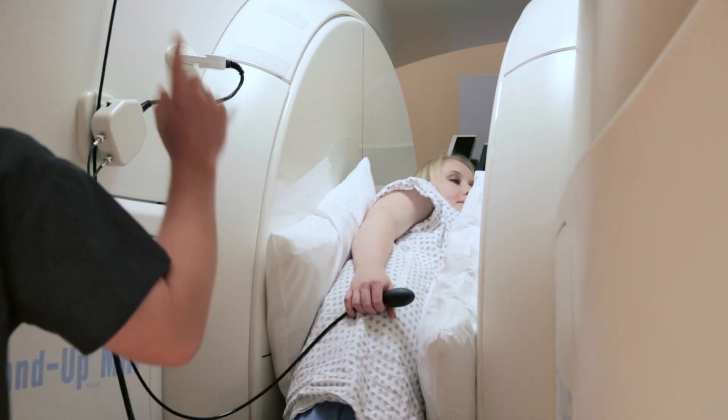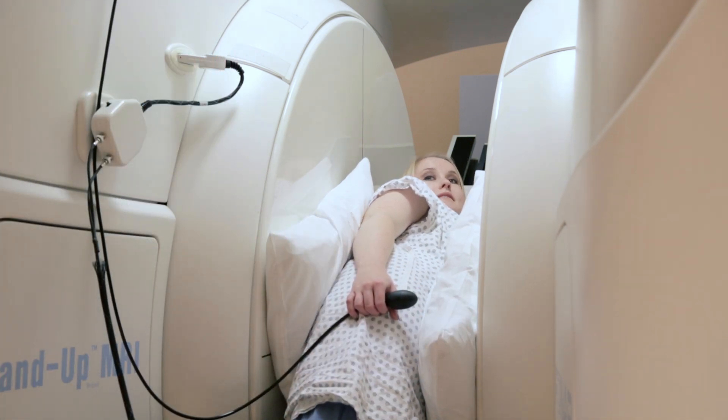Does that feel comfortable? Good. And are you still able to look out and see the TV? Yes. Excellent.